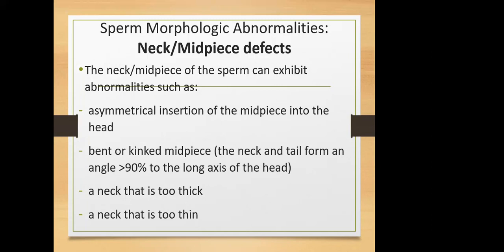When they align, they become symmetrical. I'm sure you know symmetrical. When you say something is symmetrical, it means that one half is the same as the other half. When it's asymmetrical, A means absence of symmetry. So when it is positioned in such a way that one half looks heavier than the other, then that is asymmetrical. All right.